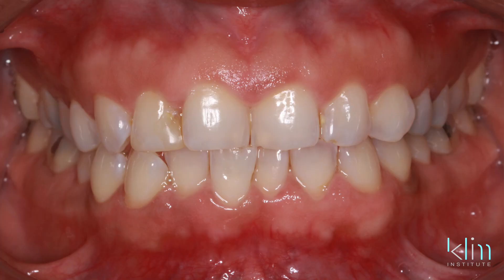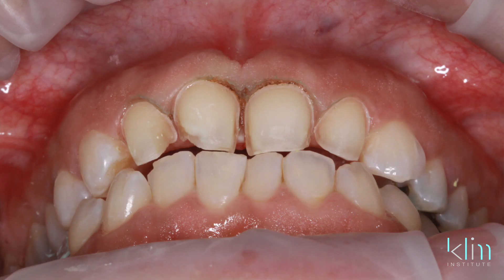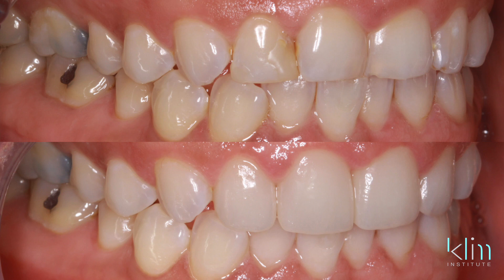Let's talk about the clinical situations where we want to use a thin margin. First of all, I want enamel on that thin margin. That way I can bond that ceramic to the margin, and I prefer a lithium disilicate — that's Emax. I can make that very, very thin. My goal with CAD-CAM is pressable margins.